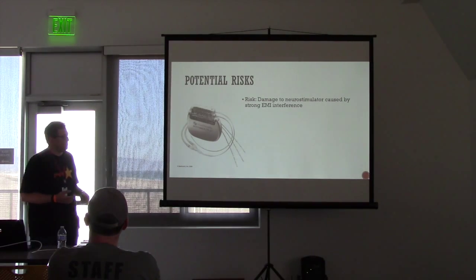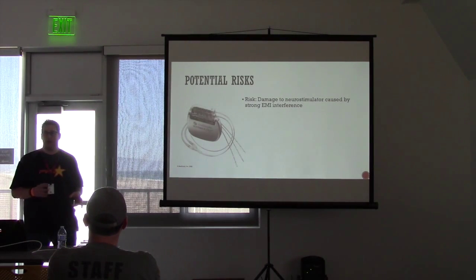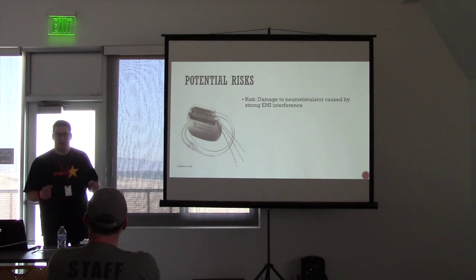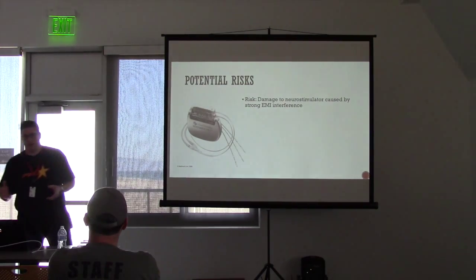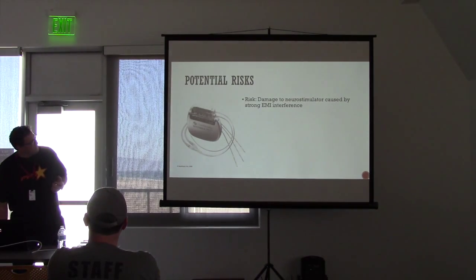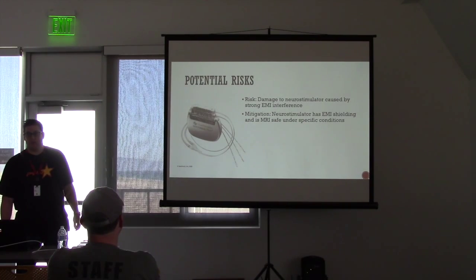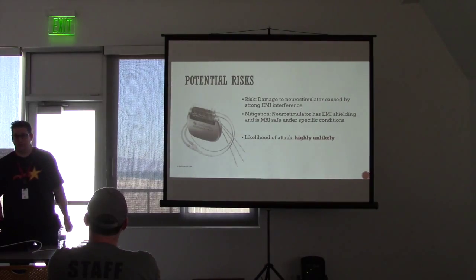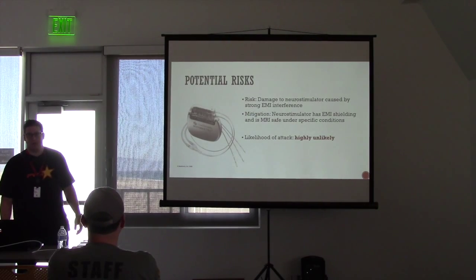And so when looking at devices, I said, all right, well, it's shielded. That means someone trying to cause damage with EMI interference would potentially have a harder time doing that. Now, if someone's walking around pointing a giant EMI gun at people, they're probably going to be noticed. So how exploitable is this? The mitigation really is the EMI shielding on the device. Likelihood of attack is highly unlikely. I think it would be pretty obvious if someone was running around trying to put a device to your back and trigger it. If you see someone with a giant antenna pointing at you, you may want to walk away.